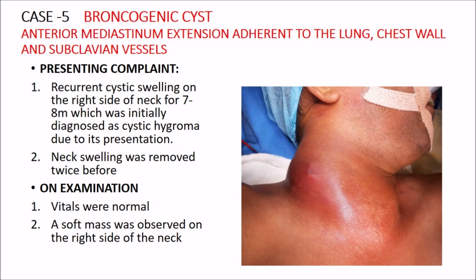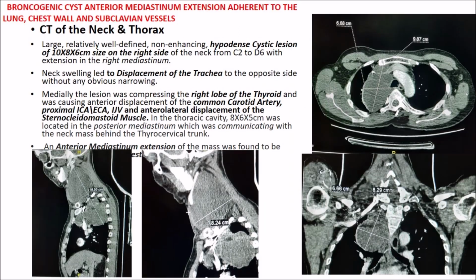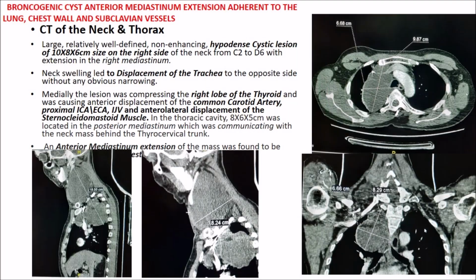So we did a CT scan, and we found that there was a huge mediastinal swelling also, communicating with the neck swelling. And this was displacing the trachea also, and it was a huge intrathoracic swelling, you can see.